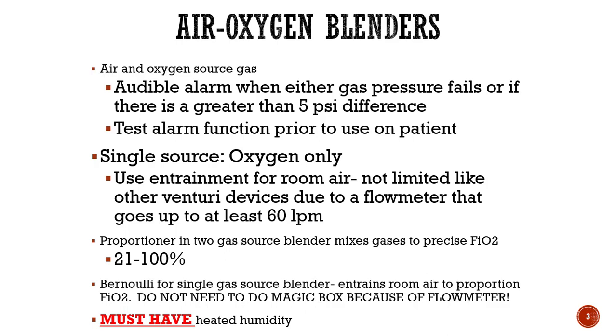And that's what this whole unit is about, understanding why humidity is important, how we can reproduce the body's natural humidity when we're using medical gases and ventilators and tracheostomies and all these other things that we use, so that we can keep lung health optimal, and we can keep people from getting worse due to secretion retention, mucus plugging, cell damage, tissue damage, all kinds of things like that. So if you're using a blender, you must have heat and humidity, always, always, always.